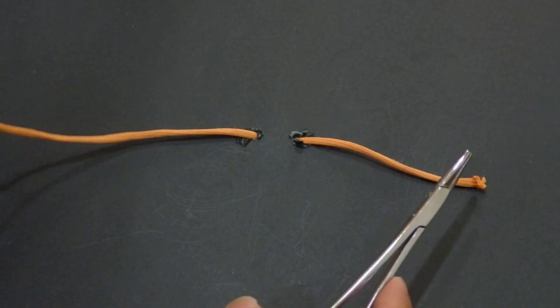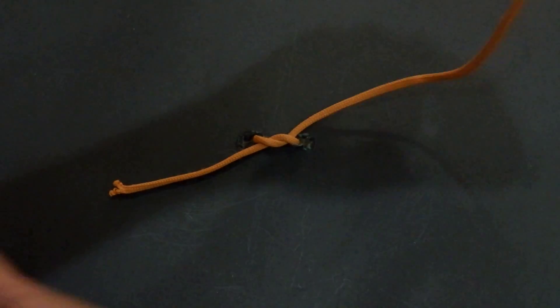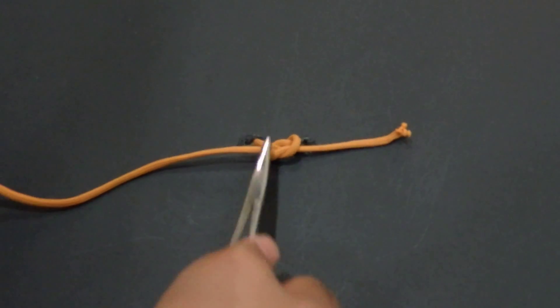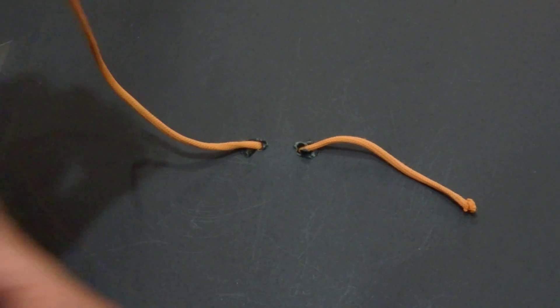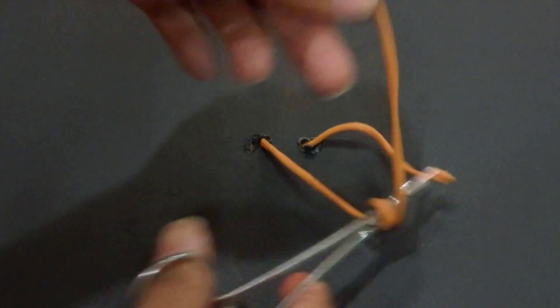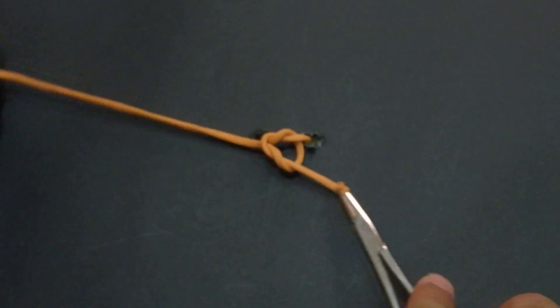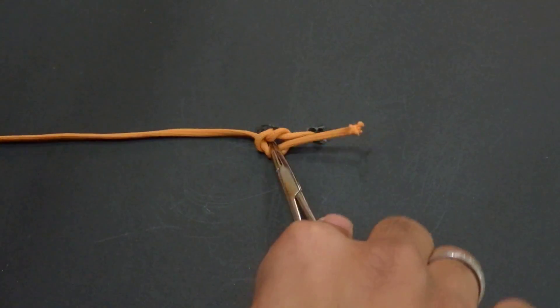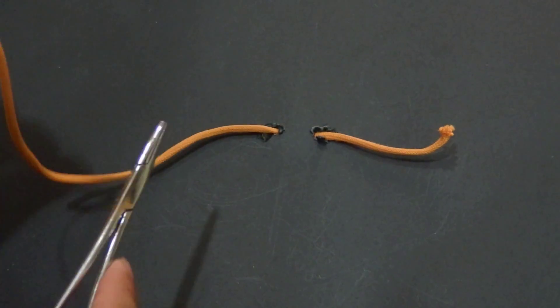I will show you examples. First, I will do it from inside — here, from inside — and the other one also from inside. Here we get the square knot. I will show you another example: if I have started from outside, bring it to that side and from outside — this is also a square knot.